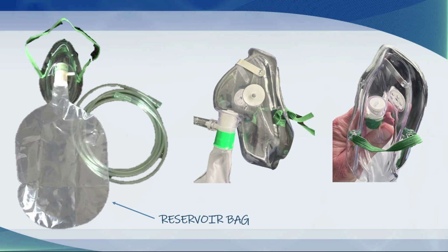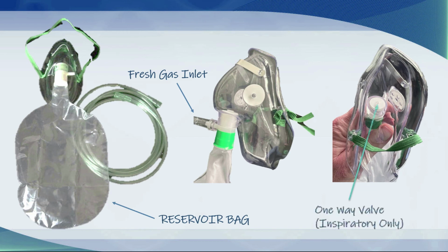Don't worry too much if the bag doesn't inflate. Well, you really should worry if the bag doesn't inflate, but you probably won't have time because you will die of hypoxemia. The whole purpose of the reservoir bag is to give you sufficient oxygen to stay alive. The components of this particular device are a fresh gas inlet here and an inspiratory one-way valve on the inside of the mask, and there are expiratory one-way valves on the side of the mask.